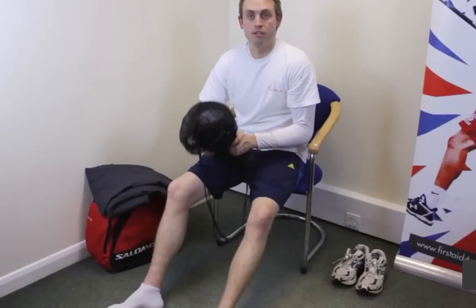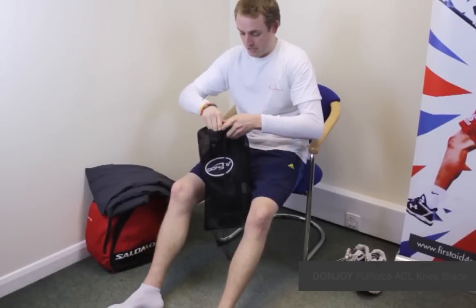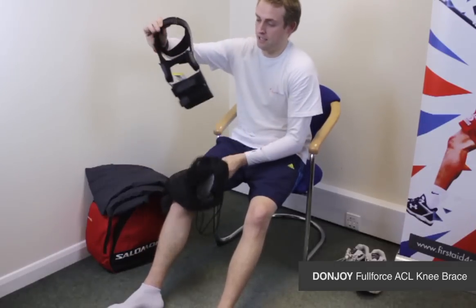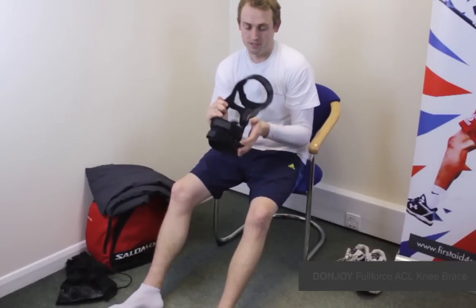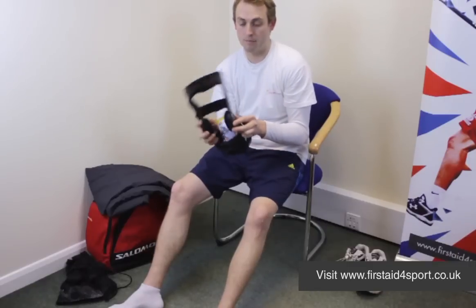I'm Michael Davison, Managing Director of First Aid for Sport, and this is the Donjoy Full Force ACL Knee Brace. It comes in the Donjoy Carry Case, and it's a really small, very light brace to help with severe ACL damage.